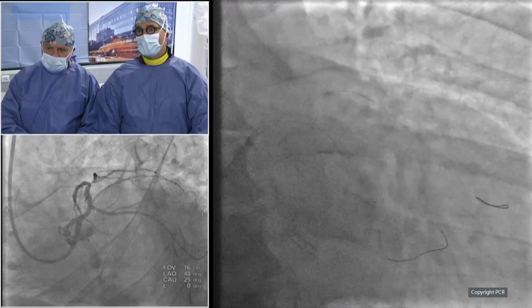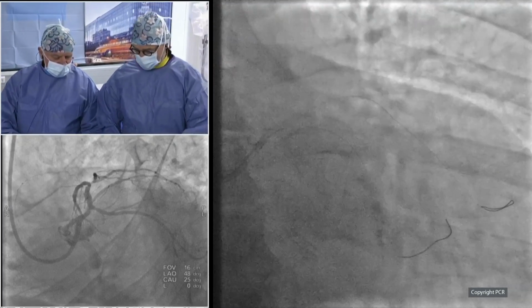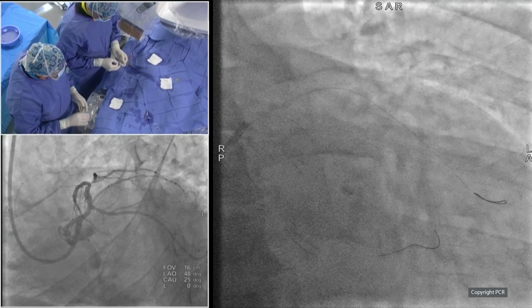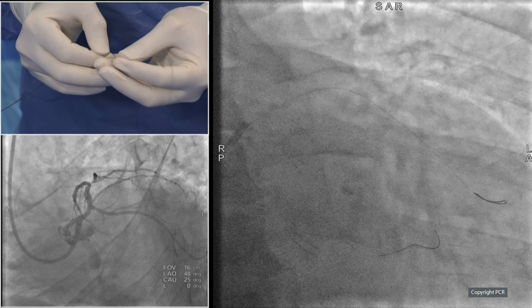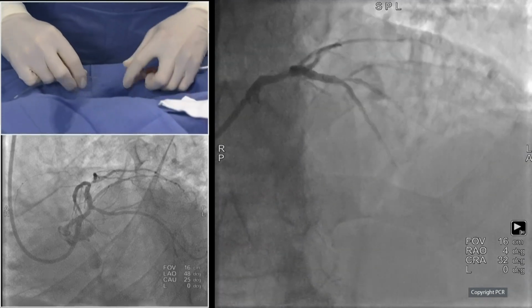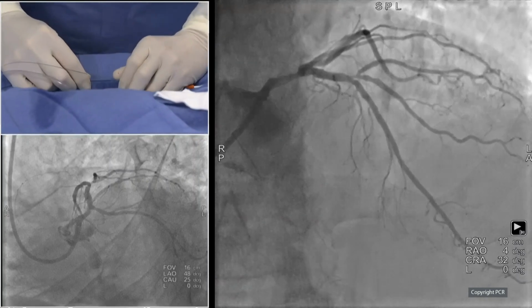We have already put in the 2 wires, as you've seen. So the first step is to do this plaque preparation with the 4.0. I don't know, Patrick or Jean, if you agree with this modification of the strategy.